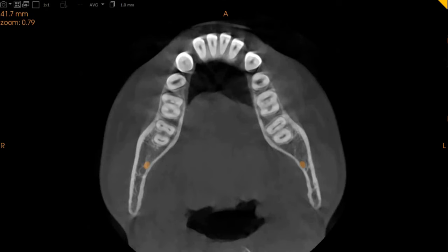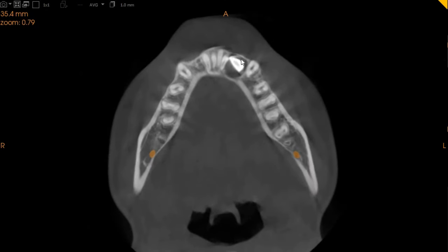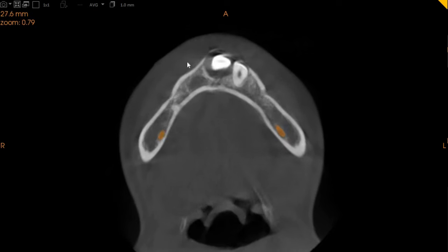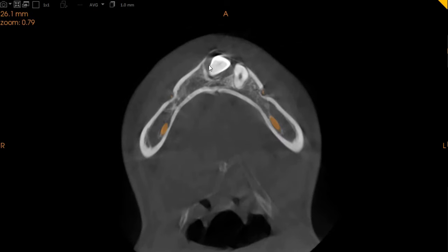As you can see from the axial view, this is the left canine right here. It's placed center of the ridge, closer to the buccal side.